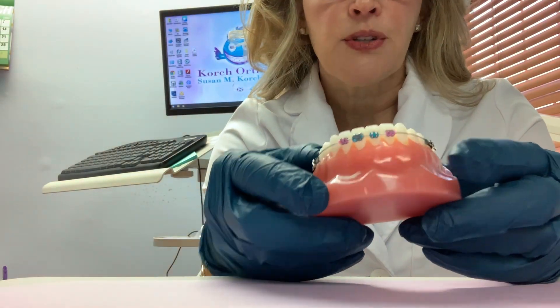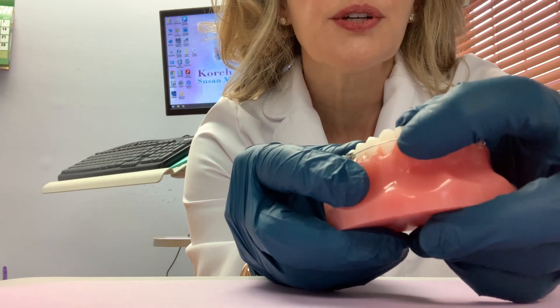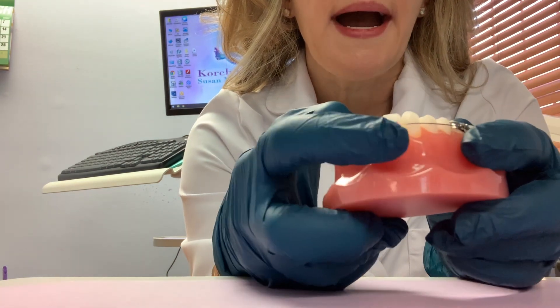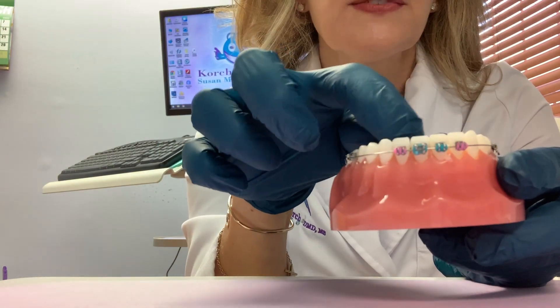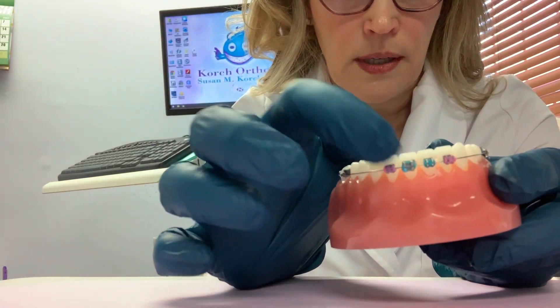One common problem that has been happening this week is if you have a loose brace and you can't secure it comfortably to the wire with the wax, and it's really bothering you — or in some cases a tooth has shifted out of place because the handle, so to speak, on that tooth is no longer connected.